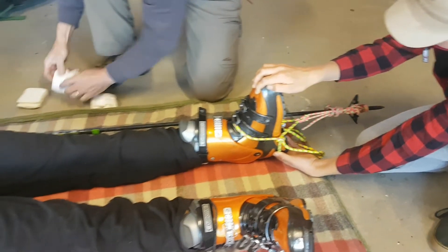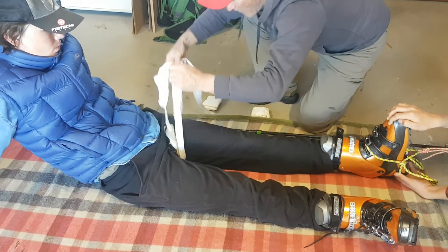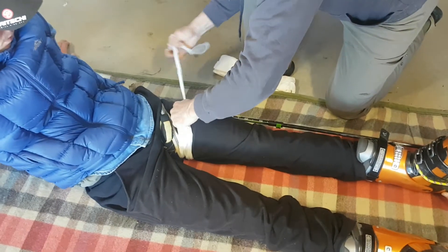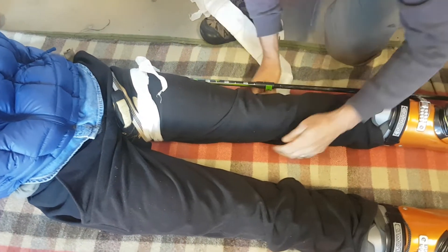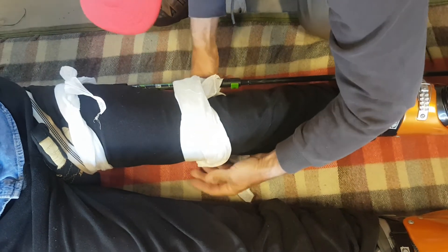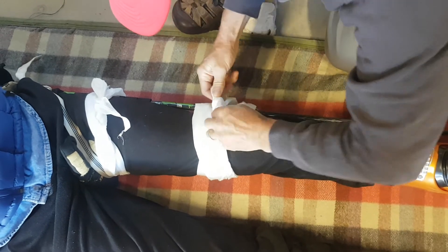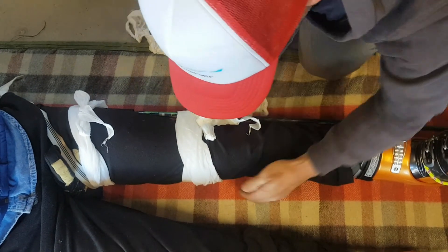You can put some tape over that, then using your triangular bandages above and below the injury, go through the hollow of the knee and bring it up above. This just helps keep the splint in place so it doesn't wobble around and hurt the injury. Don't bandage over the injury itself. Think about mechanism of injury — how old mate hurt himself. You definitely want to be considering a head injury, checking his level of consciousness. And as mentioned, check his pulse before and after, because you don't want the splinting to compromise his blood flow.